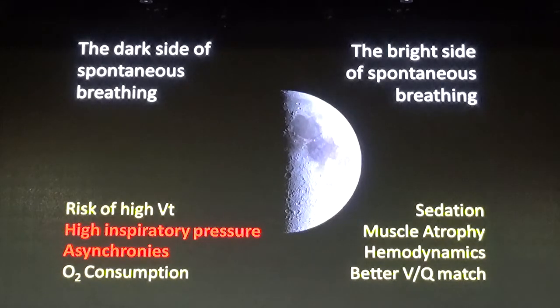But we also have to keep in mind that we pay a price to the fact that the patient is spontaneously breathing. There is also a dark side with potential remarkable side effects. We lose control over tidal volume. So the first obvious point is we have to monitor tidal volume and keep in mind that if a patient has ARDS or lung injury, tidal volume should still be in the protective range, even if there is spontaneous breathing.